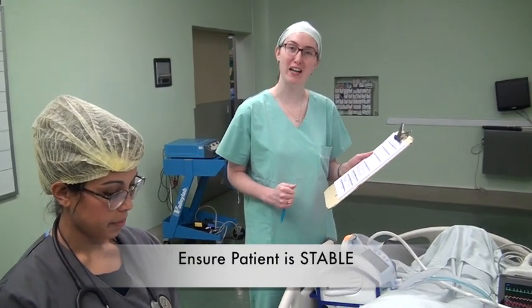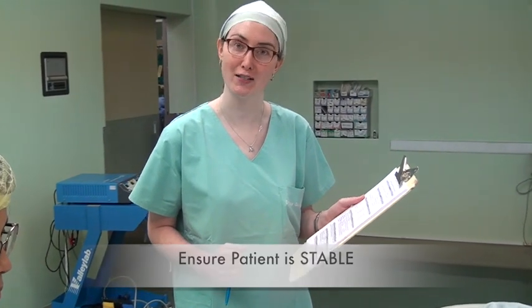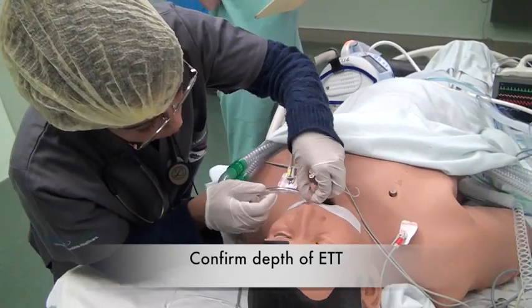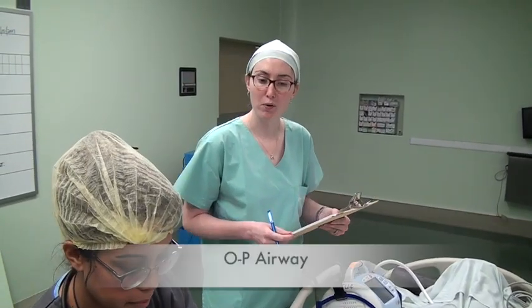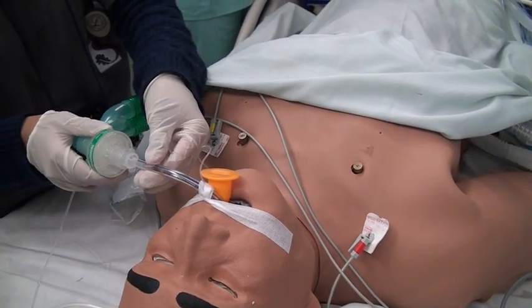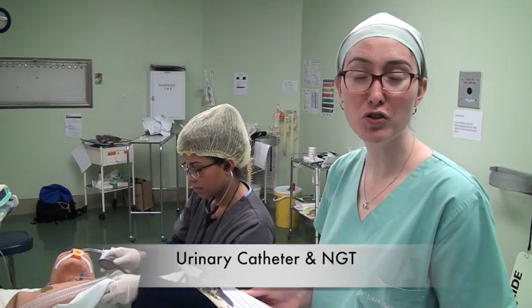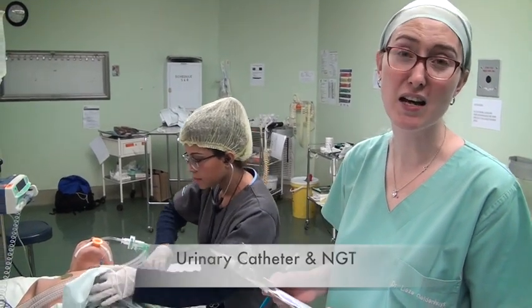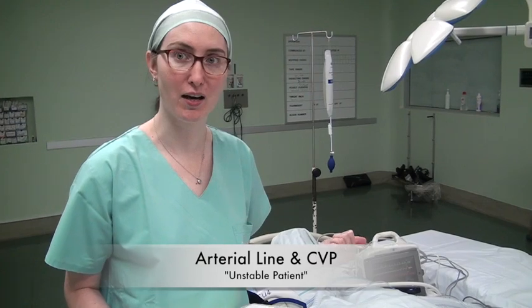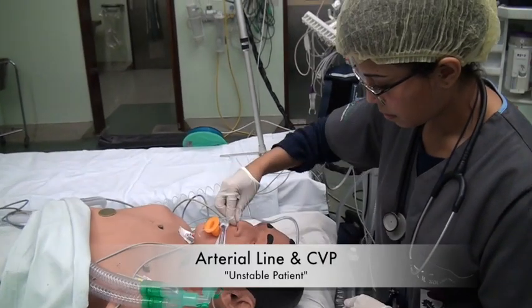We want to make sure our patient is stable and ready to be transferred by following our checklist. First, confirm the depth of the ET tube. We are placing an oropharyngeal airway so that if the patient wakes up or becomes restless, they don't bite and block their ET tube. We also need to confirm there is a urinary catheter and a nasogastric tube in place. Next, check that all IV lines are functional. Because this patient is unstable and on an inotropic infusion, he has both an arterial line and a central venous line in place.